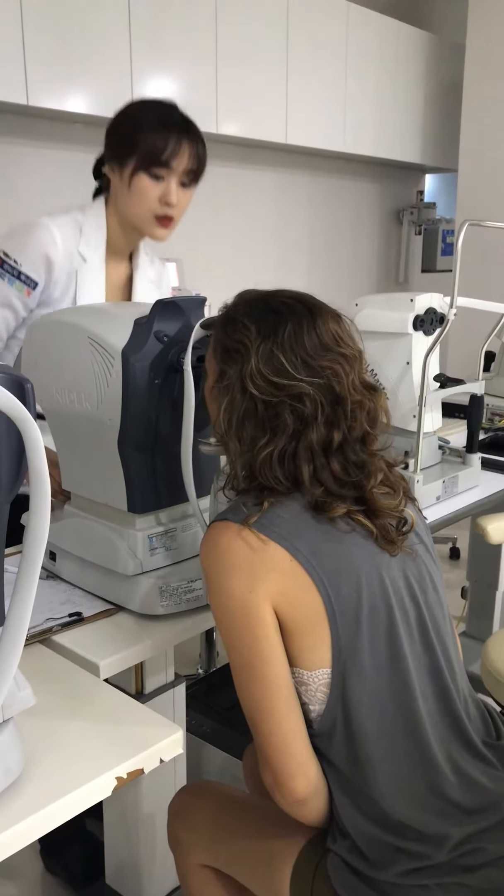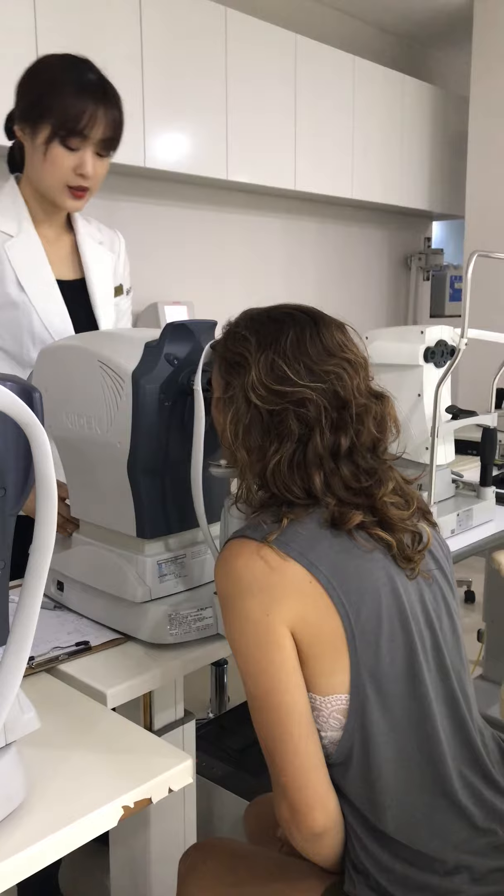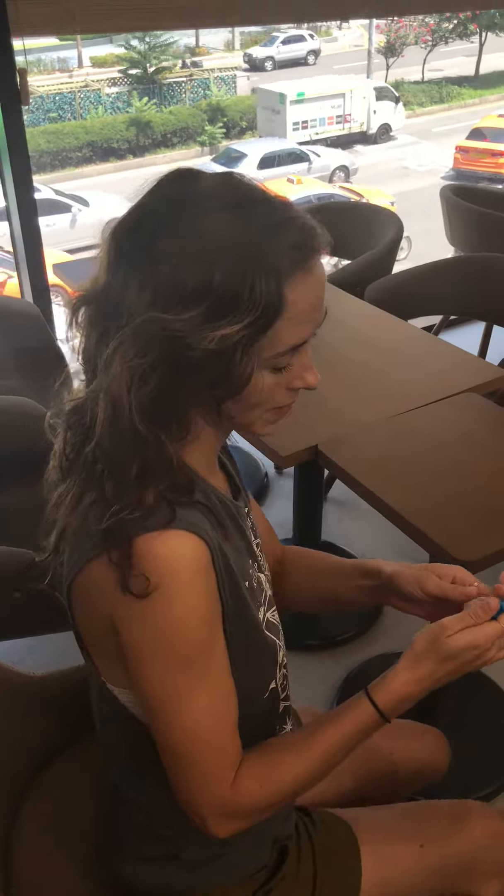Step one — checking her eyes. And she's done.